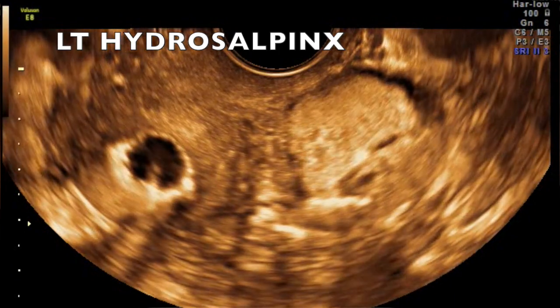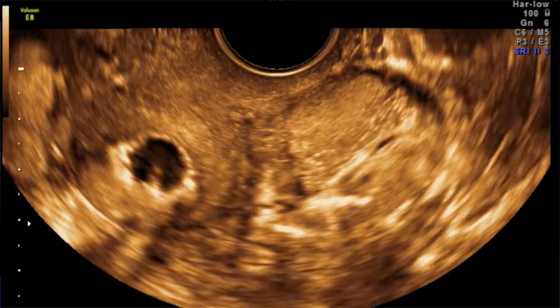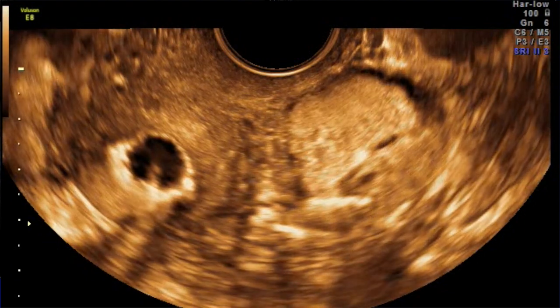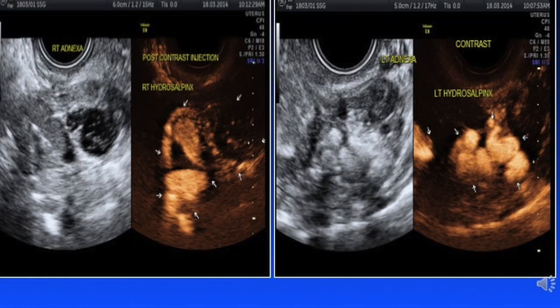And in fact, there's a hydrosalpinx on the right side as well, which was not seen on 2D examination. And we can see here bilateral hydrosalpinx with the contrast persisting within the hydrosalpinx. This is a delayed post-contrast study after about 5 minutes, which still showed the contrast within the hydrosalpinx.